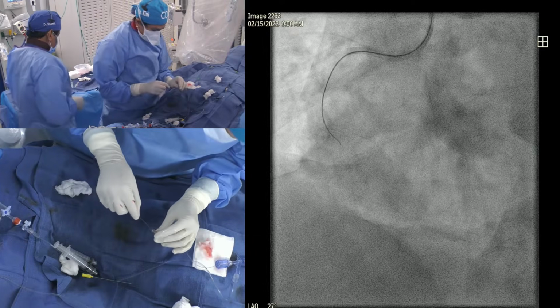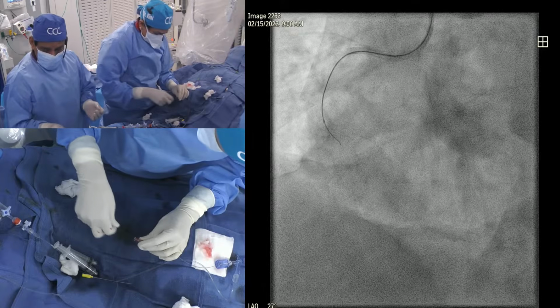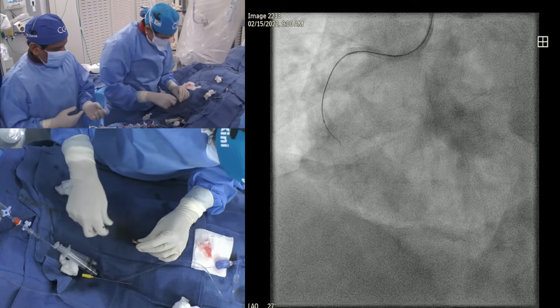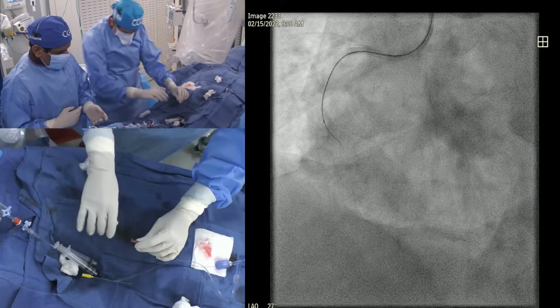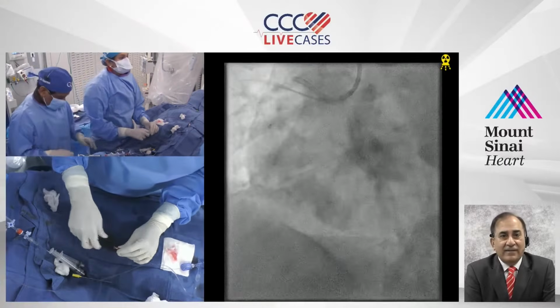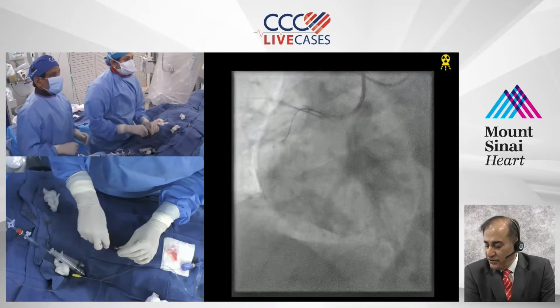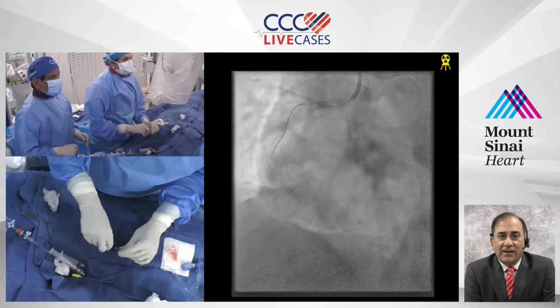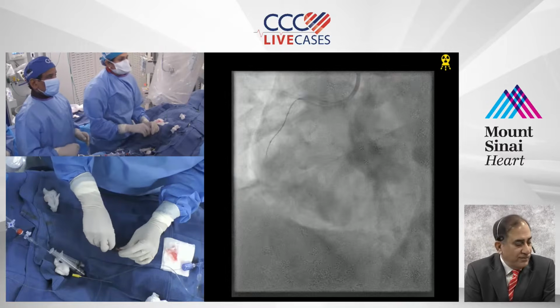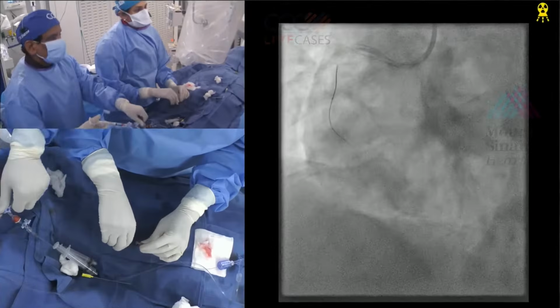Though they say they use Asahi engineers to make this wire. It would be very fascinating to see. I actually have a couple of exceptional CTO users in Japan. I'm going to query them as to how different their portfolio of wires is.